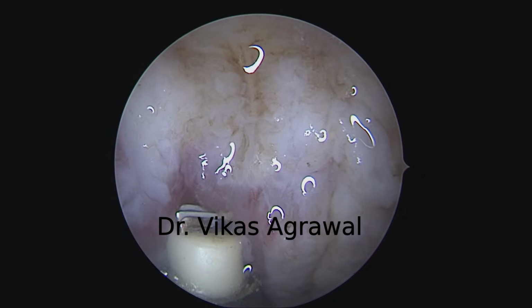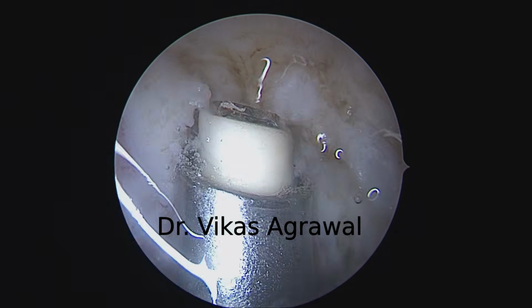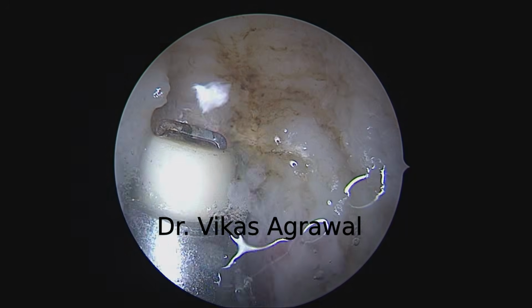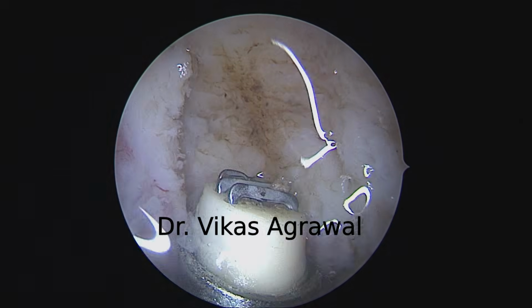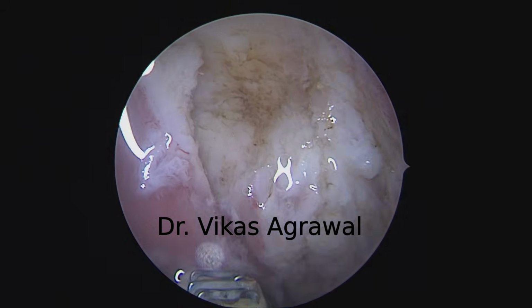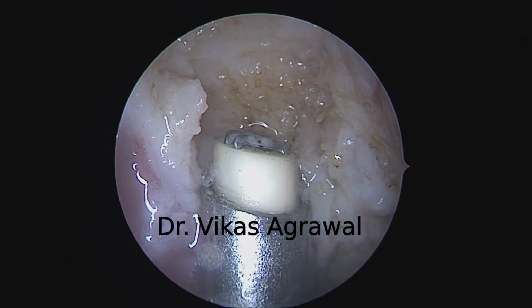So what was looking like adequate surgery, now you see how much tissue was still there to be removed. And this was done by a senior surgeon known for sleep apnea. Now you see that's the posterior boundary, the buccopharyngeal fascia.